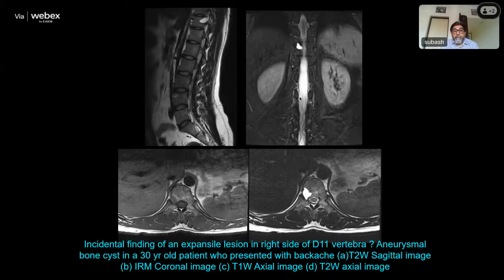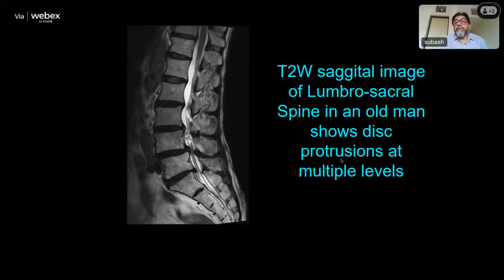So this is a bone cyst you can see here, which is again visualized by MRI very nicely. This is a coronal slice, this is a sagittal slice, and these are the axial slices. You can see how beautifully this bone cyst lesion appears. Since it is bright in T2, it is a cystic lesion, and you see T1 is showing a dark, not so bright lesion here. So this is a cystic lesion, which is shown by the combination of T1 and T2 weighted images.